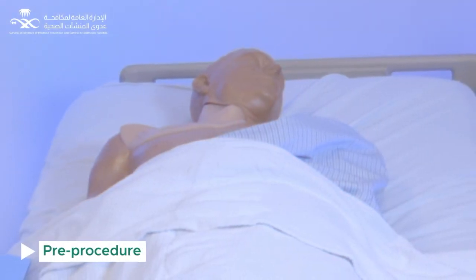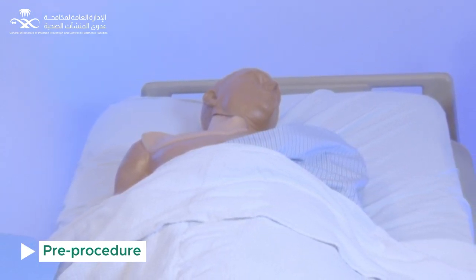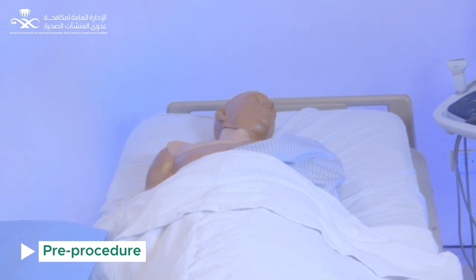When there is indication for central line insertion, check patient identification. Explain the procedure and risks to the patient or family and take consent. Keep in mind to follow components of central line insertion bundles.